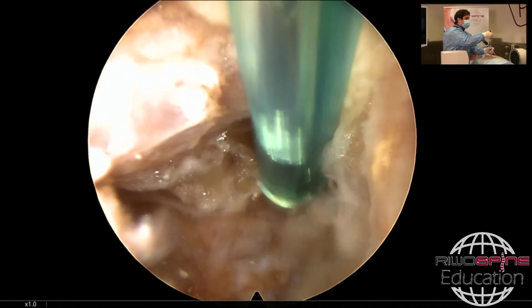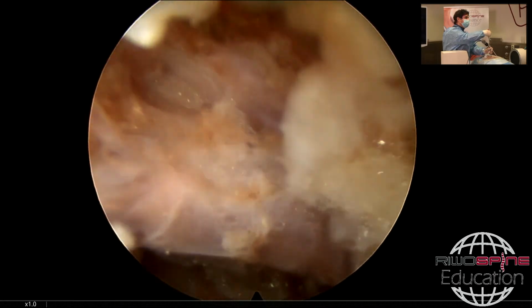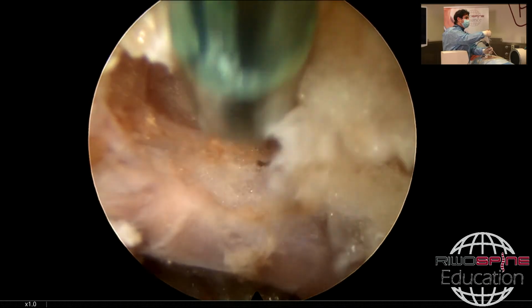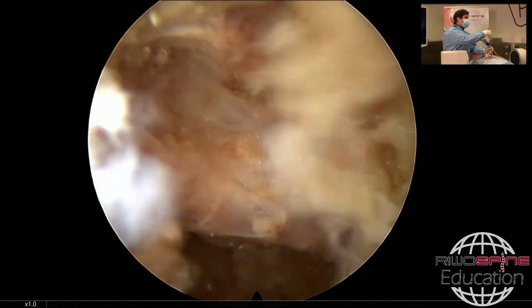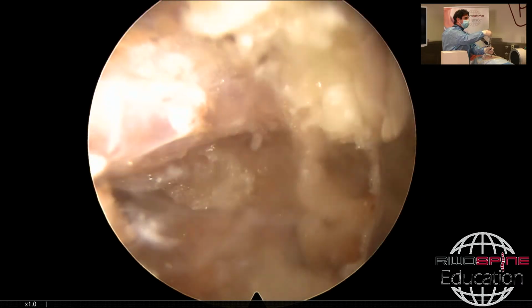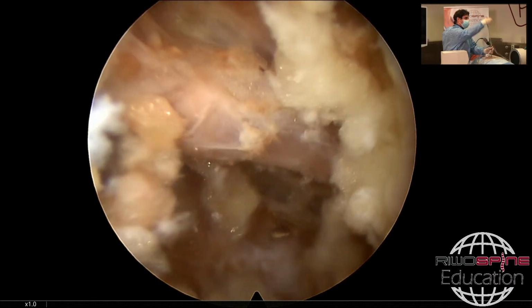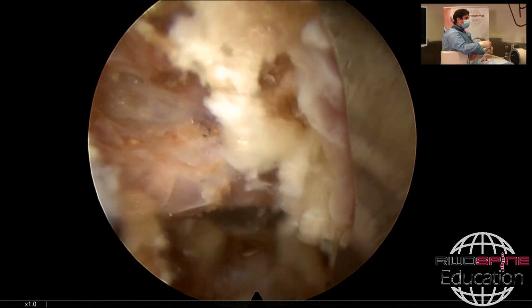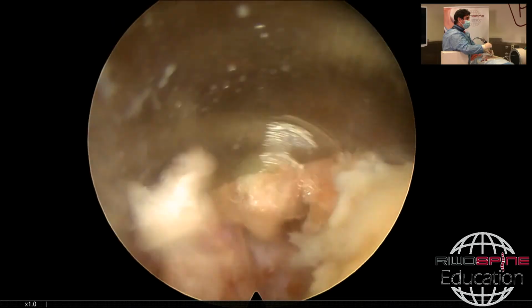Okay, I see the neural structures here, and then when I go to the medial side, I see another one. It looks like an axilla here, that I can see easily at the level of L5S1. And then what I can do, can place my cannula here and rotate 180 degrees.